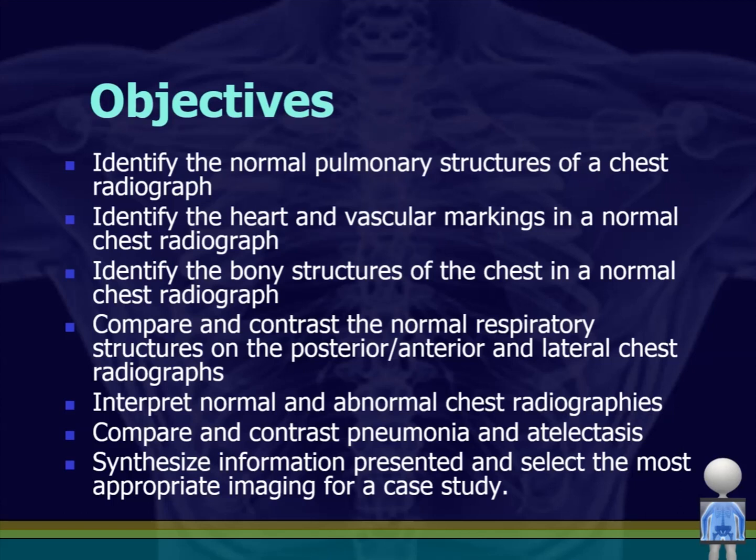Also looking at why you would pick something. So when do you need a lateral film, for example? What's a PA versus an AP? How would you order what you need based on what's in front of you?